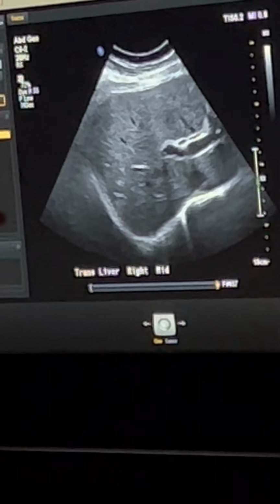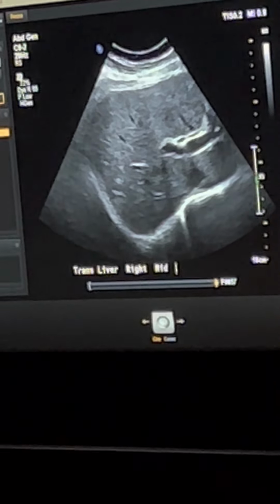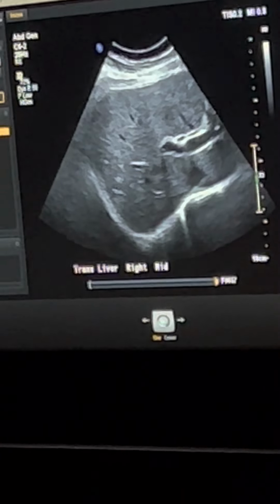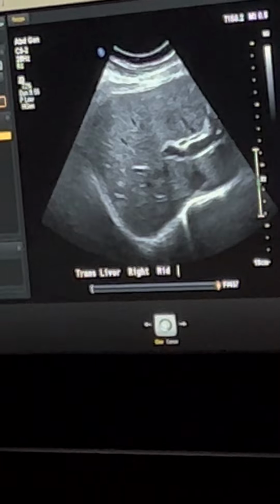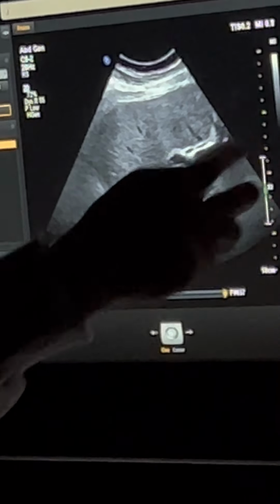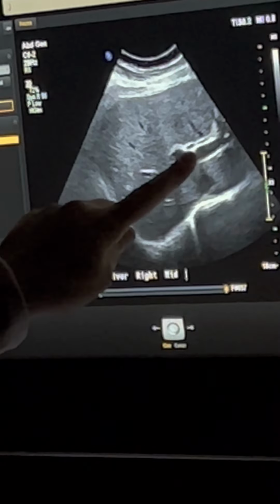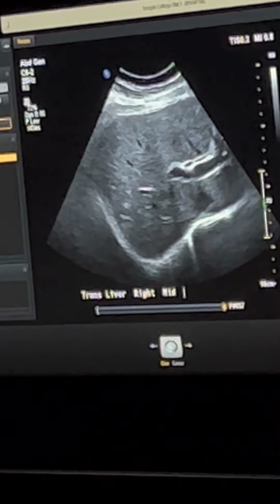Now, the same rule kind of applies when we were talking about left lobe. If I'm cutting this portion off here, I don't care. I already took pictures of that. That's the left lobe. Focus on getting this margin just as well, okay? Don't get too far over this way because then you're re-imaging the left lobe. So you're going to see that main portal vein come in there. That's probably your hepatic artery right there.